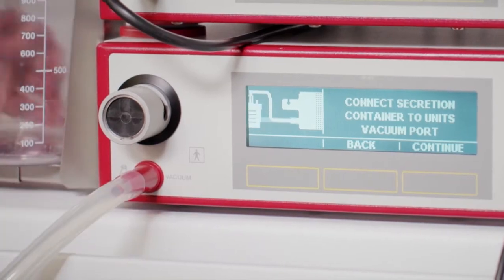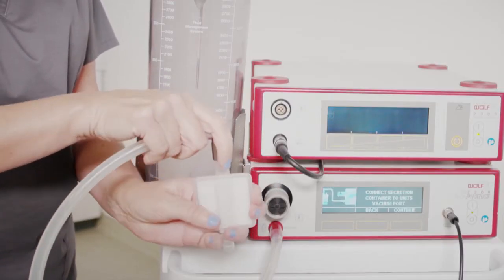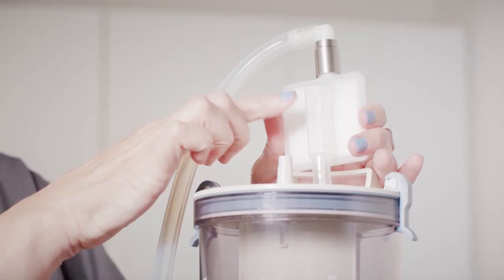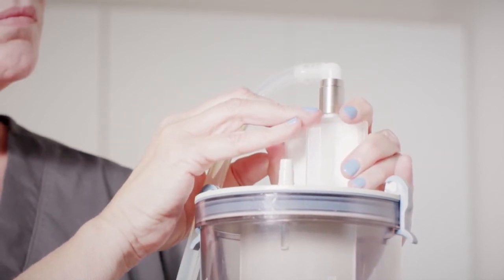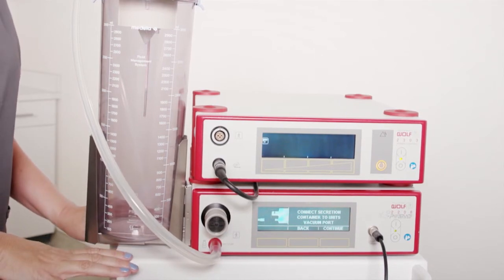Connect the red end of the vacuum tube to the vacuum connector on the device. Connect the elbow connector of the vacuum tube to the overflow protection filter. You then want to connect the assembled tube and filter to the lid of the secretion container with the arrow pointing towards the vacuum port. We are now ready to move to the sterile field setup.